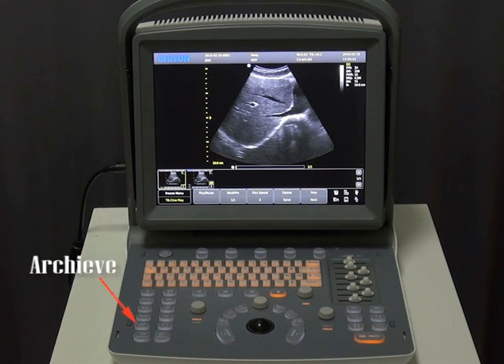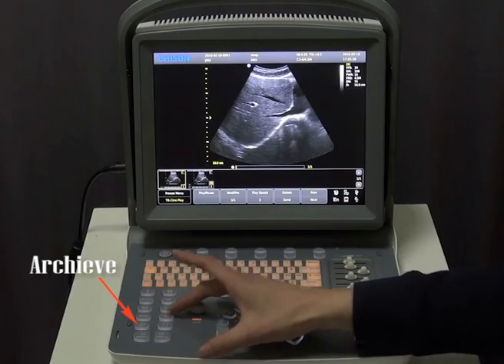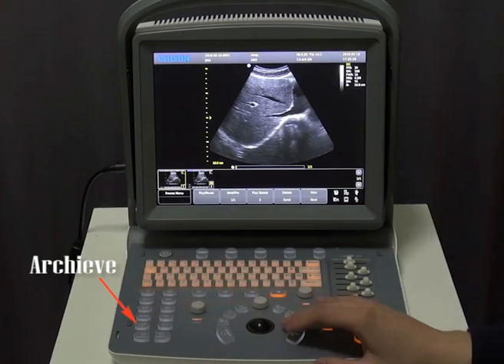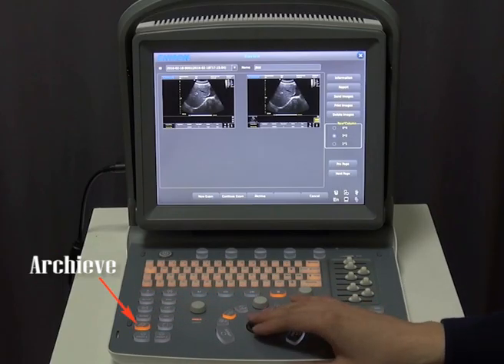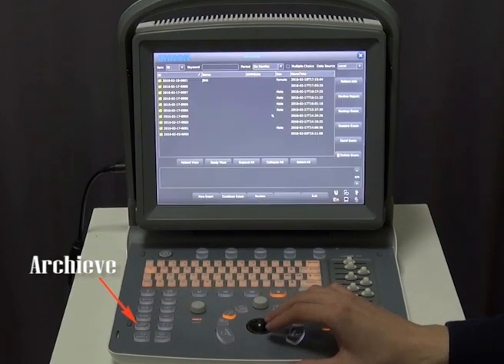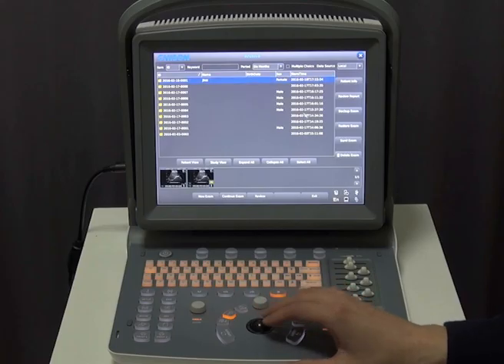As the images have been saved in the machine, we have several ways to export them. Press the archive key and select Archive. Then you can choose to send or backup the images.